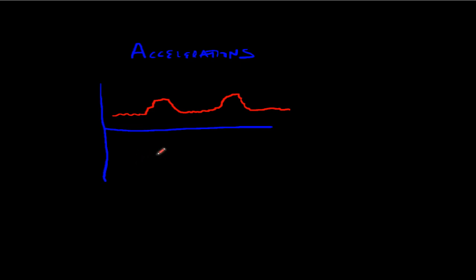And these can be gestational age dependent. So when we're greater than 32 weeks, we're looking at 15 beats above the baseline and something that lasts for 15 seconds. So there's our 15 above, and here's our duration of 15 seconds.